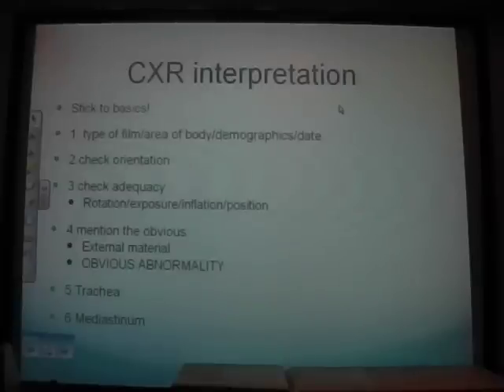Mention the obvious. As a final year, in your OSCE you probably won't have time because it will be just after a respiratory station. If they've changed anything, it may be a separate station. In that case, go through everything systematically. But if it's just, here's a chest X-ray after your respiratory station, what do you think? Say, okay, this is a chest X-ray of Mr Smith, who's 72 years old. This is a chest radiograph. It's an AP film. The most obvious abnormality is he's got a tension pneumothorax. And then if they want to ask you any more questions, they will ask you.